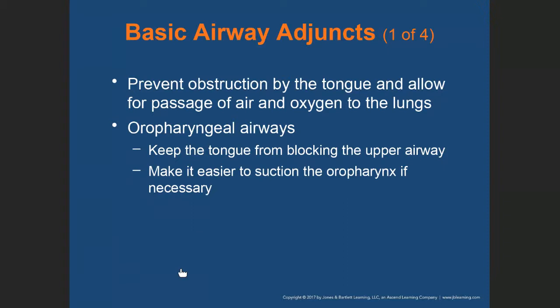Now, the indication for an oral airway is important. This is something you will be tested on. So pay attention now. There are 3 things that must be present for you to use an oropharyngeal airway on your patient. If you have not assessed for these 3 things, you should not be using the airway adjunct. So you must assess before you manage. You cannot manage what you have not assessed. And this is where persons kill patients in the field. This is where EMT students fail skill station. You cannot manage what you have not assessed.